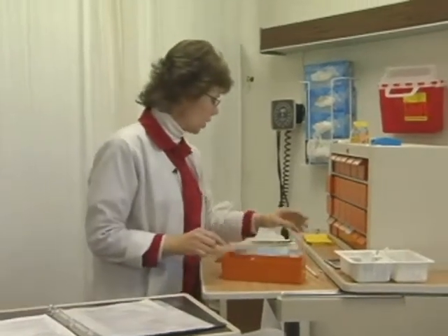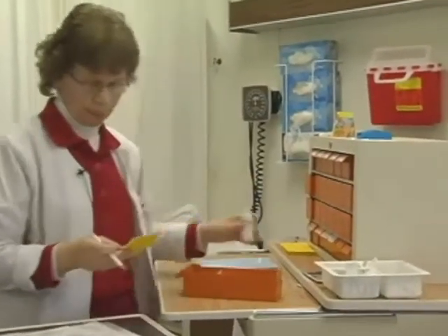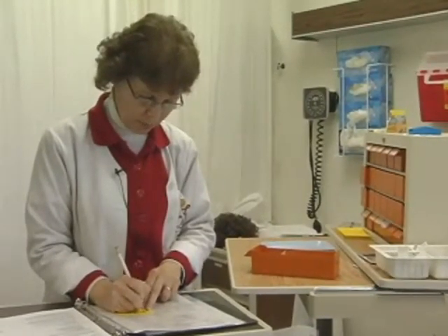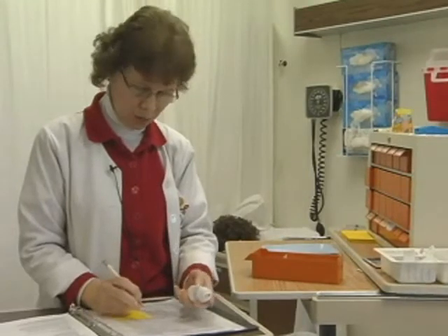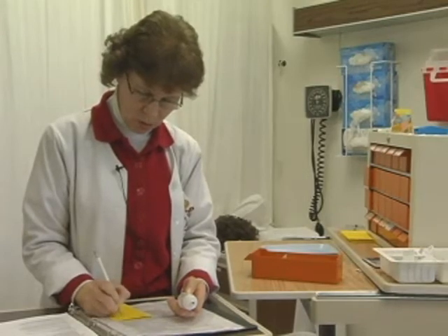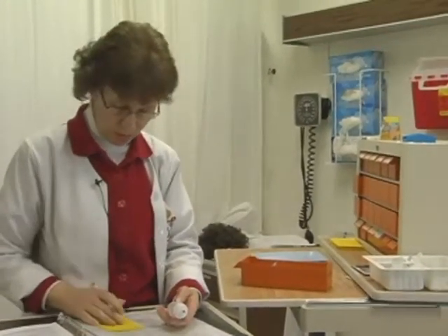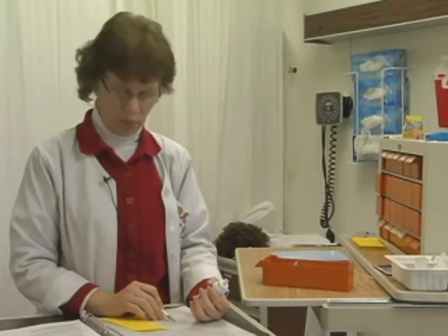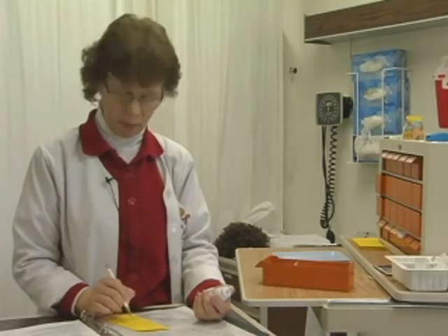It is now 8 a.m., and so that's been more than 4 hours, so it's safe to give. Okay, so now I'm going to do my calculations. I have Zofran. The dose ordered is 4 milligrams over the amount that it's supplied in, which is 2 milligrams per ml, and that comes out to 2 mLs, so I will draw up 2 mLs. And then I'll do my calculation for the amount of time that it's to be given over. It's to be given over 2 minutes, and there are 4 30-second intervals in 2 minutes. So I'm going to divide my dose, which is 2 mLs, by 4, and that comes up to 0.5 mLs, and I'll give that every 30 seconds.